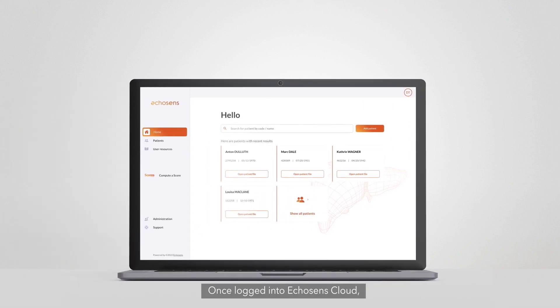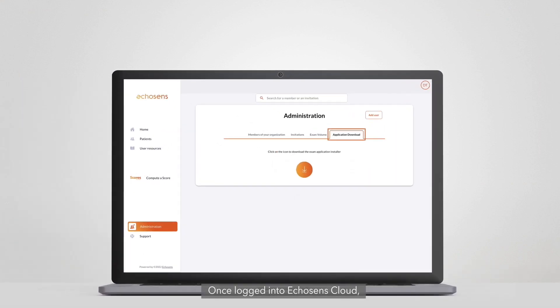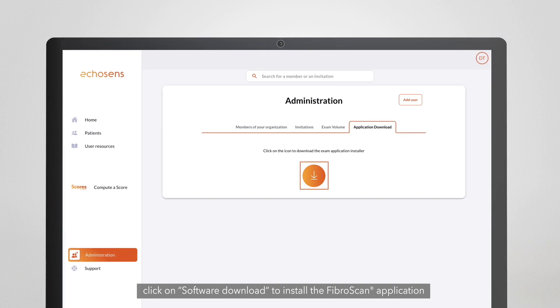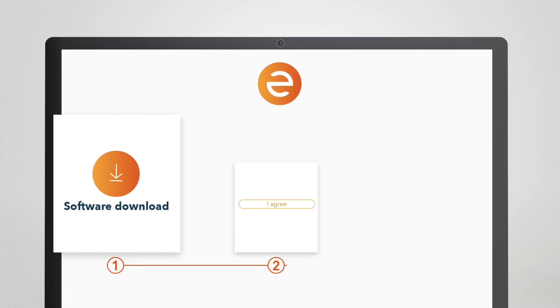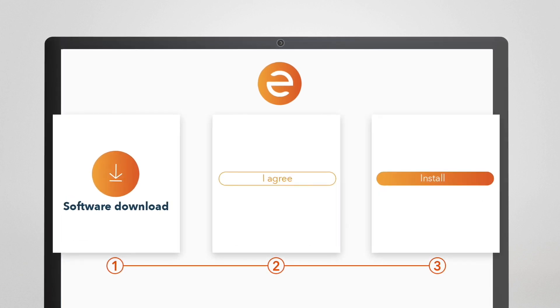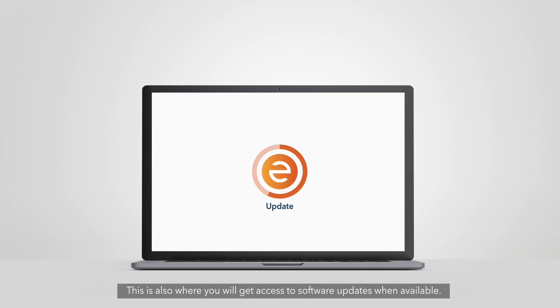Once logged in to Echosense cloud, click on Software Download to install the FibroScan application required to perform the examination. This is also where you will get access to software updates when available.